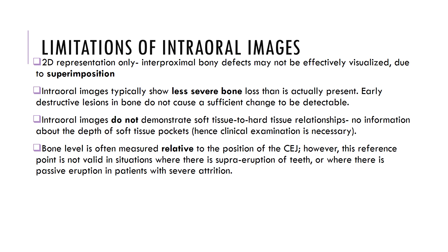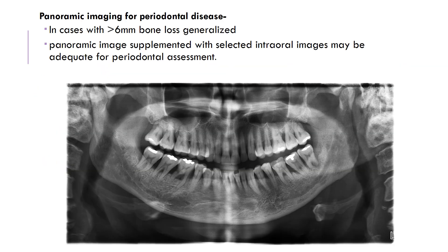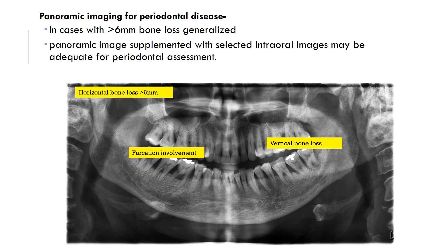Nevertheless, intraoral images are the backbone of diagnosis and treatment planning for any form of dental disease. Panoramic imaging is also very useful for periodontal diseases, more so in cases where there is more than 6mm bone loss overall, and panoramic images supplemented with selected intraoral images are very adequate for periodontal assessment. For example, the panoramic image shown here demonstrates multiple areas of bone loss greater than 6mm.